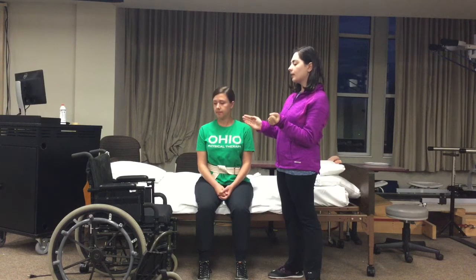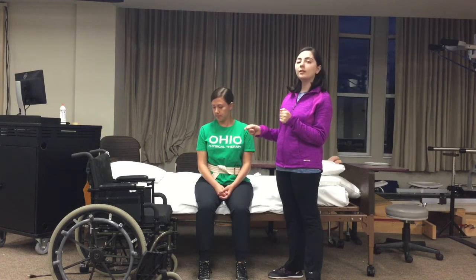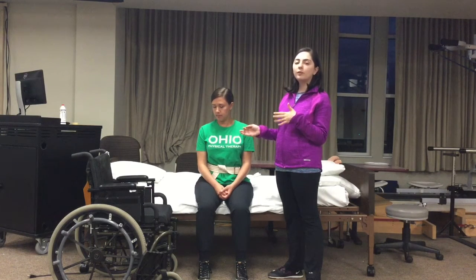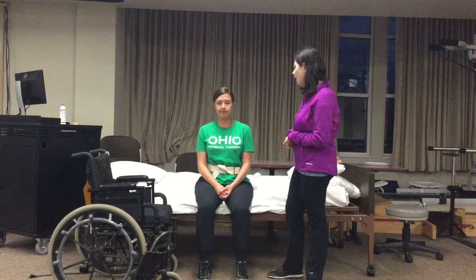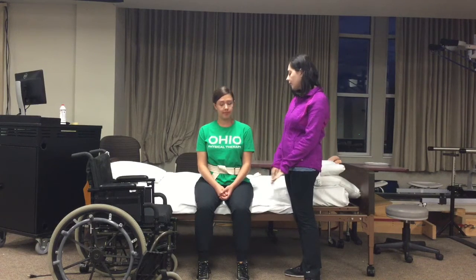Before starting the transfer, we need to prepare the environment, so make sure that the chair is placed parallel to the bed, that it's locked, and make sure that the footrests are either moved to the side or removed if they are removable. For wheelchair skills, you can refer to skill number 17. The patient needs to be seated at the edge of the bed, as shown in skill number 21, with their feet flat on the ground.